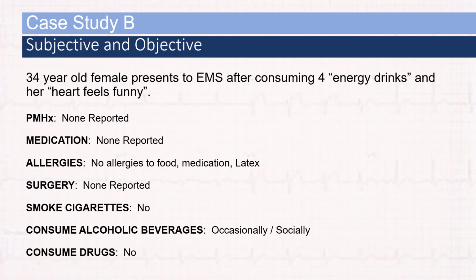Let's take a look at this case study. You're called to assist a 34-year-old female who presents to EMS after consuming 4 energy drinks, and her heart feels funny. She doesn't have any past medical history. She doesn't have any prescribed medication, no allergies to food, medicine, or latex. No major surgery reported. She doesn't smoke. She only consumes alcoholic beverages occasionally, and she doesn't consume drugs.